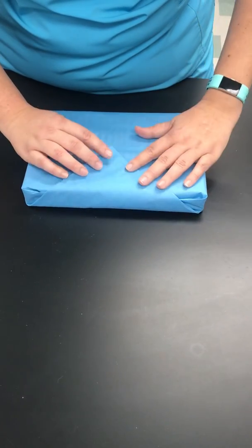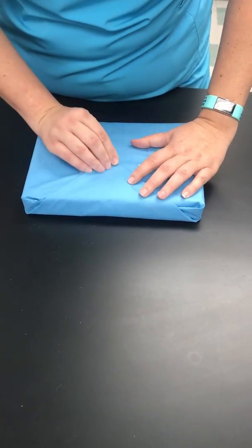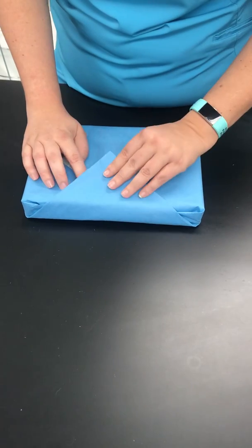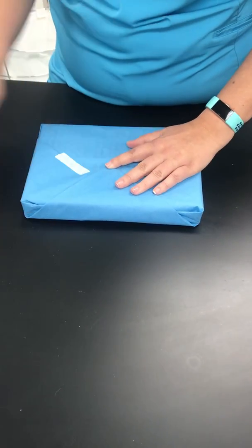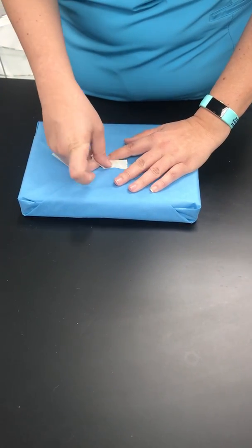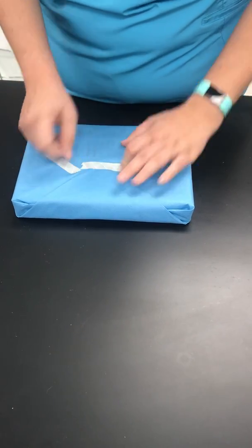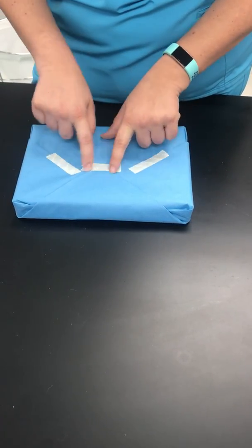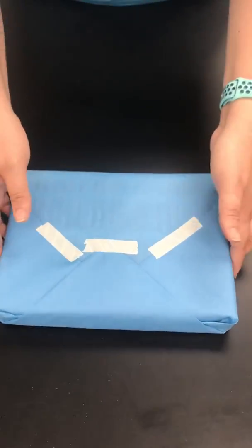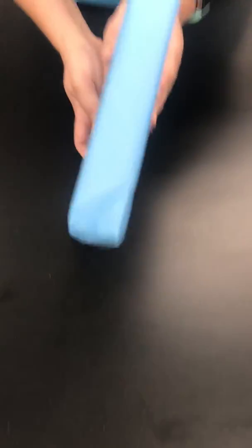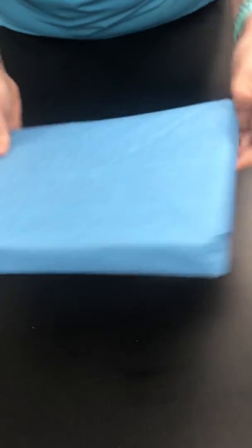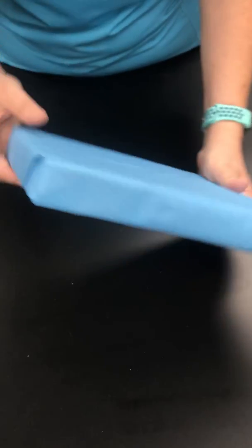So your end product for the hospital surgical wrap will look somewhat like an envelope. You want to make sure that the tape covers the entire tip of the triangle. You don't want any gaps visible.